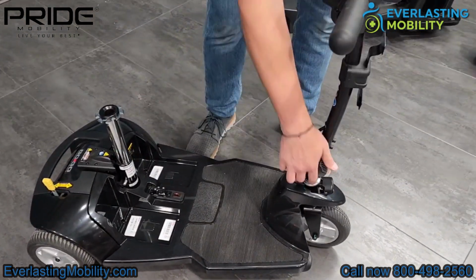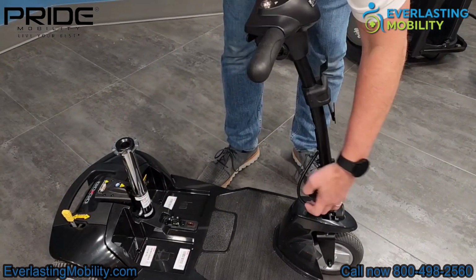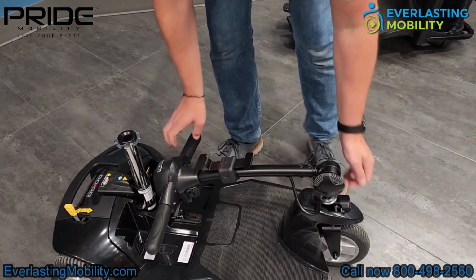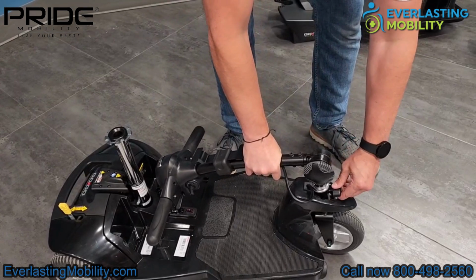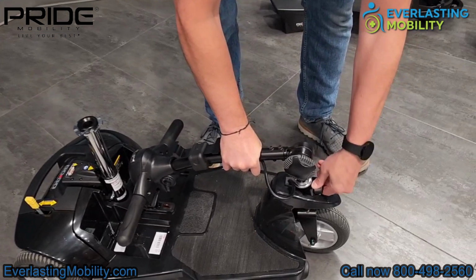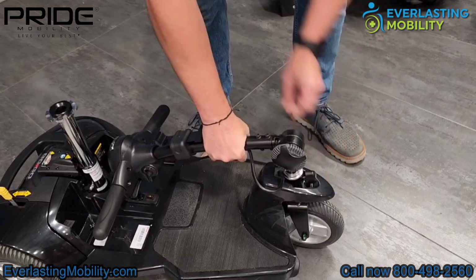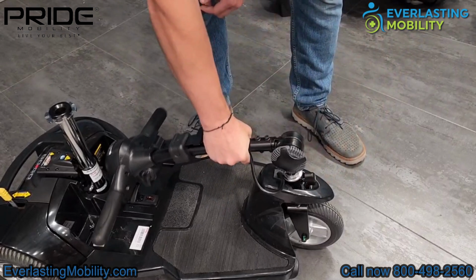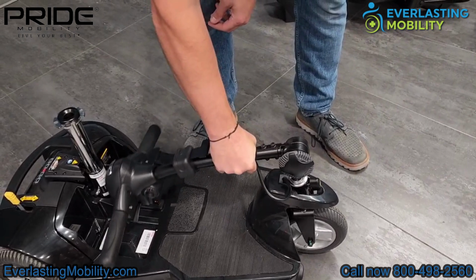The next step is you would use the tiller adjusting knob and adjust it down towards the floorboard, and then you would secure it in place. Now there is another knob that's on the front, right above the front wheel. It's important to lock that into place. If you don't do that, then the tiller can jump around while it's in transit if you were traveling in your car with this. So you want to make sure that you lock this other locking mechanism in place, and you can see it doesn't move once you do that.